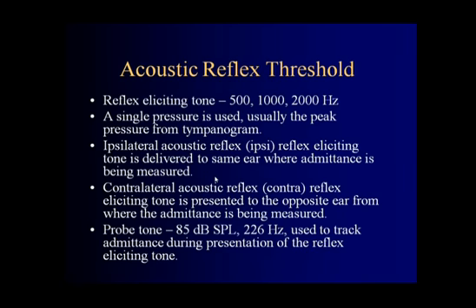Okay, the reflex eliciting tone is 500, 1000, or 2000 hertz. These are all pure tones. A single pressure is presented inside the external ear canal, usually the peak pressure from the tympanogram. Ipsilateral acoustic reflexes, or IPSI: the reflex eliciting tone is delivered to the same ear where admittance is being measured. So for ipsilateral acoustic reflex measurements, we have the probe tone and the reflex eliciting tone in the same ear.